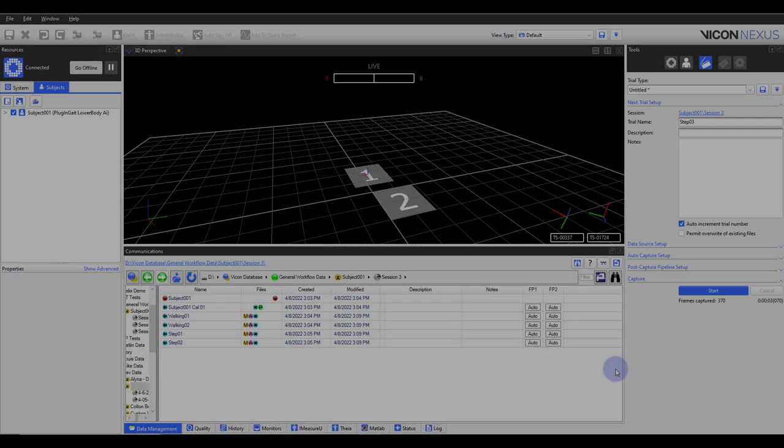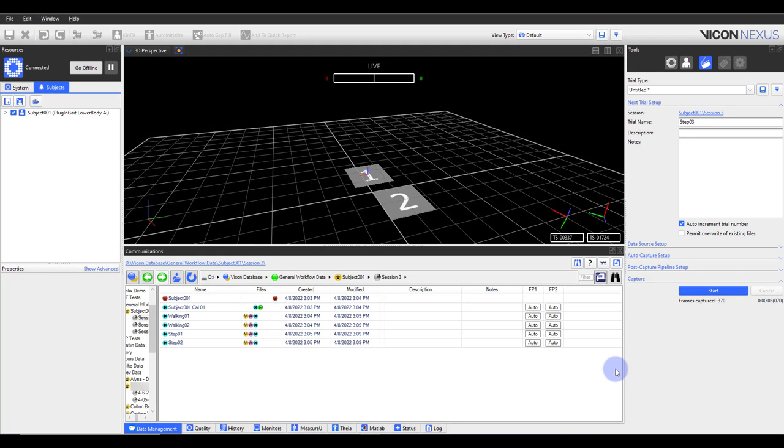If you have collected IMU data in Nexus, it is essential to transfer the data from the IMU sensors before processing your data. If a trial is open before transferring the data, the preview data will be seen, which is at a lower sample rate and subject to gaps due to Bluetooth interruptions.